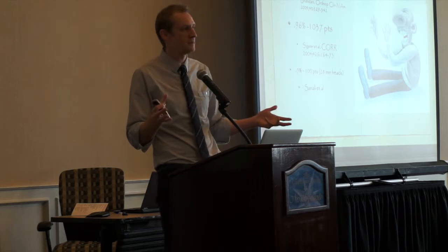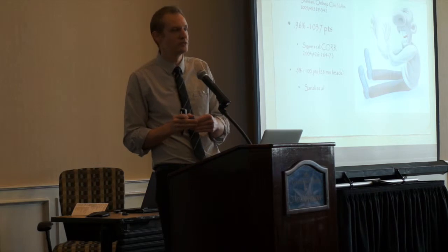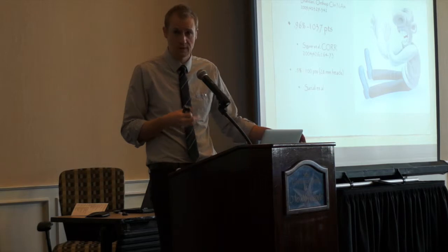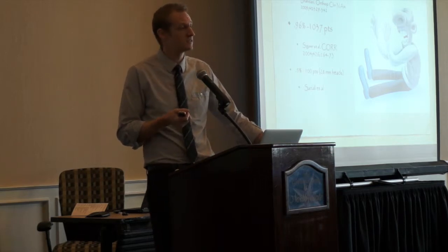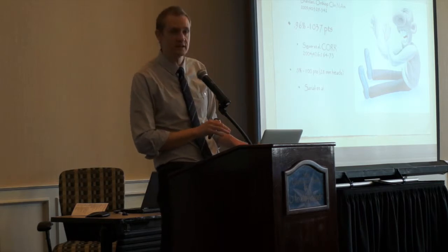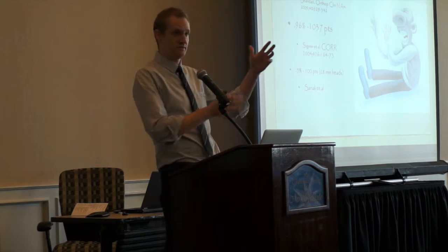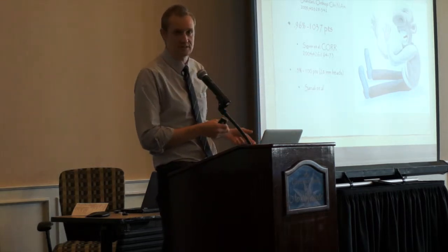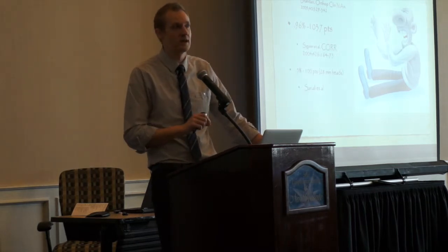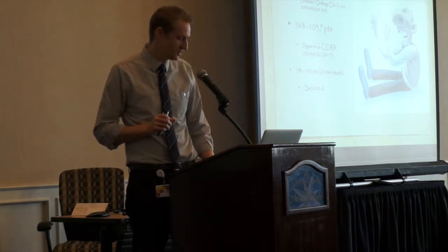That's pretty much a common size head nowadays to be the minimum. Very rarely do we ever use a smaller diameter head than 28 millimeters. And part of that is because of the lower dislocation rate as the head gets bigger. So if you look at that study alone and include their 22 millimeter heads, which goes all the way back to when total hips first came about, that was the size of head that they used, the dislocation rate jumps to 1.5%. So with modern day size heads, again, a study showed 0.5%.